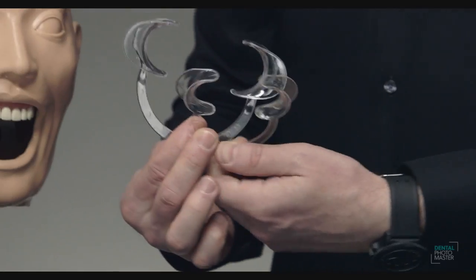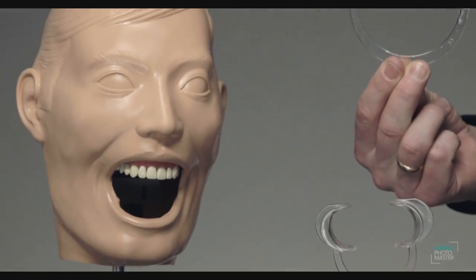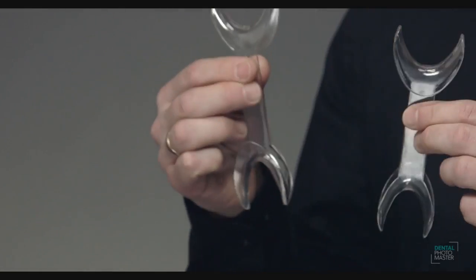When I started with dental photography it was almost 20 years ago. It was totally different because we were limited with the number of accessories available on the market. Nowadays it's different — we have plenty of different producers and companies making these accessories, and our life is much easier.